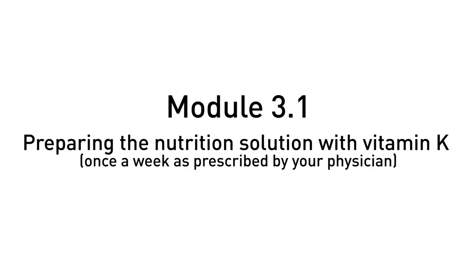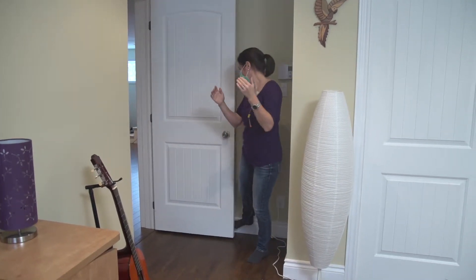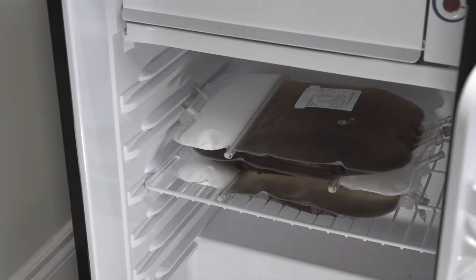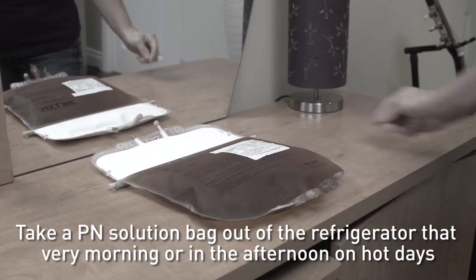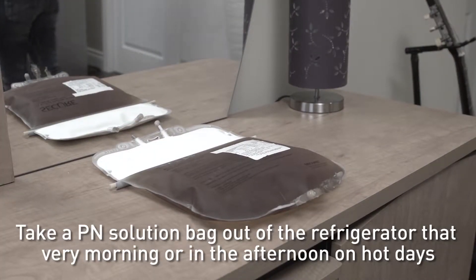You are now ready to prepare the PN solution with vitamin K once a week as prescribed by your physician. We remind you that you must keep the solution in the refrigerator and take it out on the same day it is administered, or in the afternoon on hot days. Do not expose the PN solution bag to sunlight.